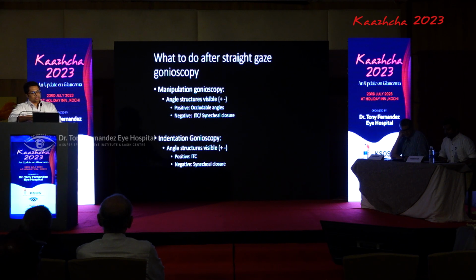So with indentation, if you can open up the angle, then there is no synechiae, it is just an iridotrabecular contact or an appositional angle closure. Whereas if you are not able to open up the angle, then it is a synechial angle closure.